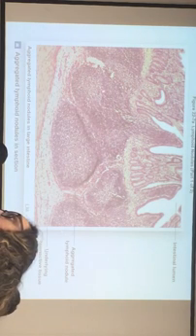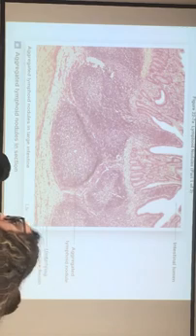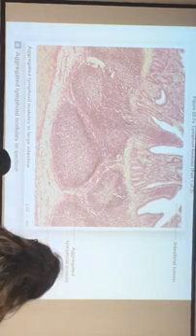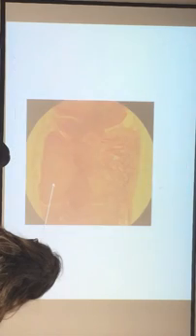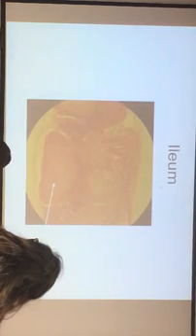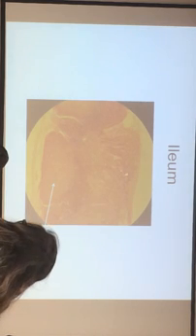And in the lower part of the large intestine, they have a lot of these too. We can look at it on our slide. Here is the epithelium cell, and it's very close to the epithelium cell, so we call it mucosa associated. It can send out T lymphocytes. This one is in the lower part of the small intestine, which we call the ileum. You have a whole bunch of these, and they can send out T lymphocytes.